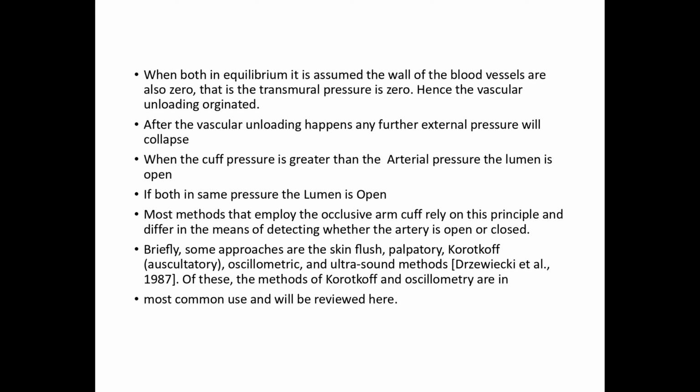In all present multi-para monitors, most methods that employ the occlusive arm cuff rely on this vascular unloading principle, and differ in the means of detecting whether the artery is open or closed. There are a few methods to find out whether the artery is open or closed.